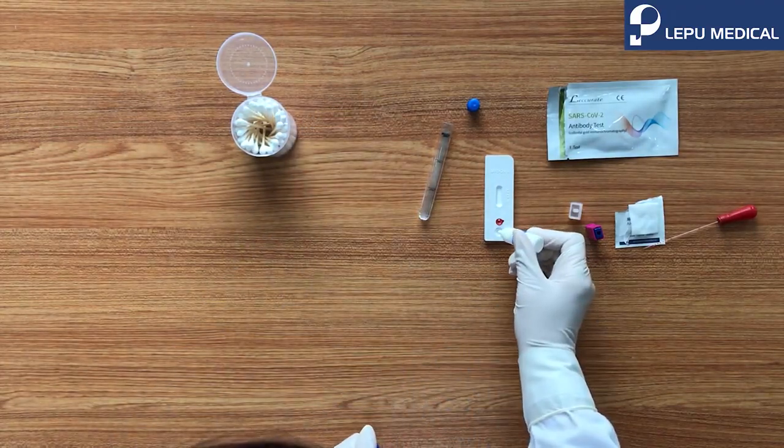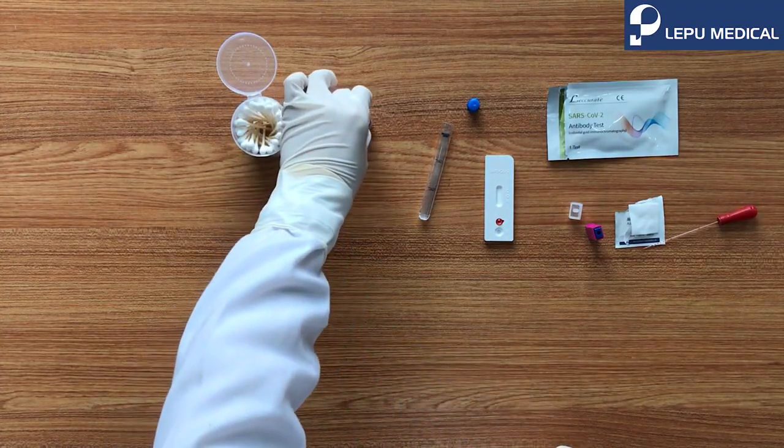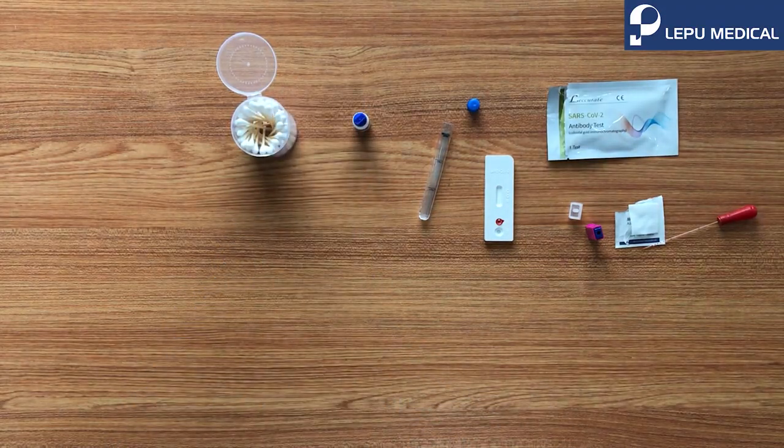Open the cap of the buffer, add two drops to sample well B, and screw the cap back on. Wait for the red line to appear in the window. The test result should be read within 10 to 20 minutes.